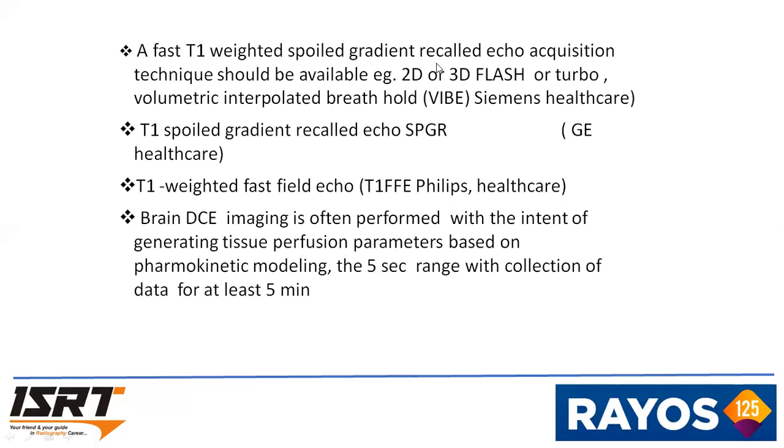T1 weighted spoiled gradient recalled echo acquisition techniques should be available: 2D or 3D FLASH, and turbo volumetric interpolated breath hold, that is the VIBE sequence in Siemens Healthcare; on the GE, it is SPGR; and on the Philips, T1 FFE, fast field echo.